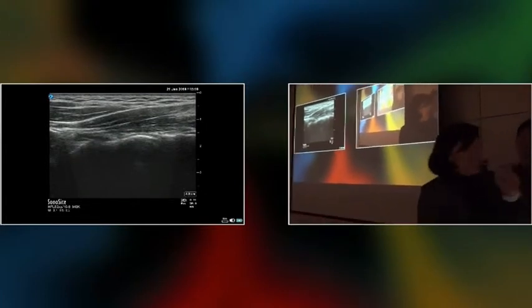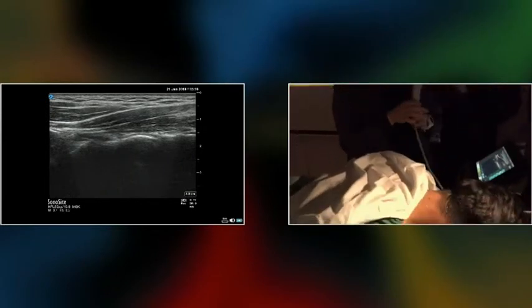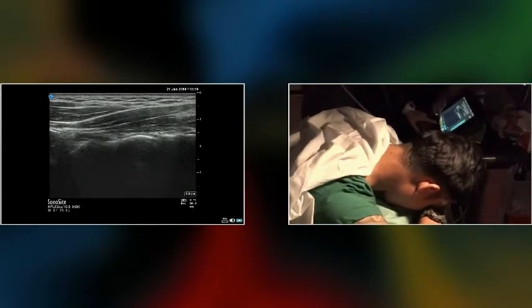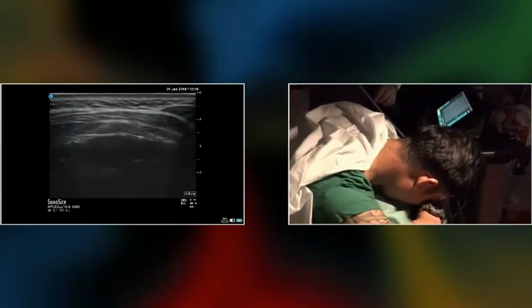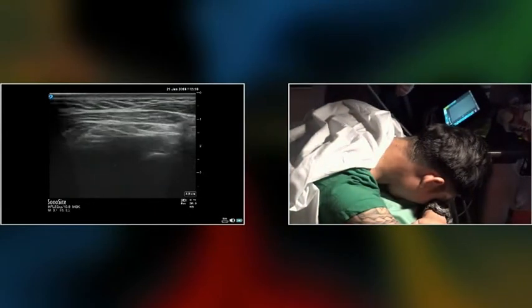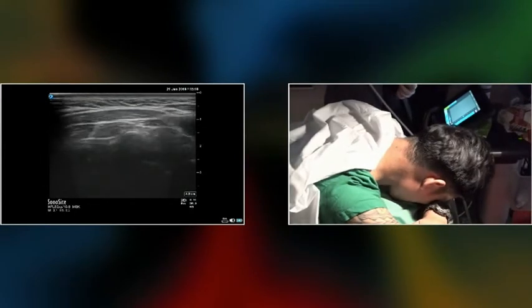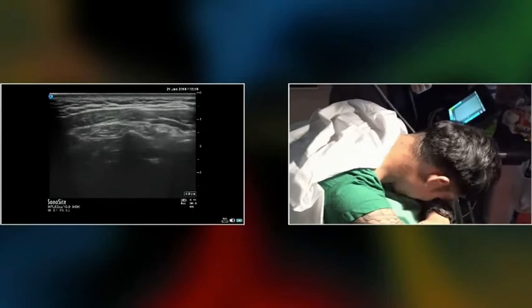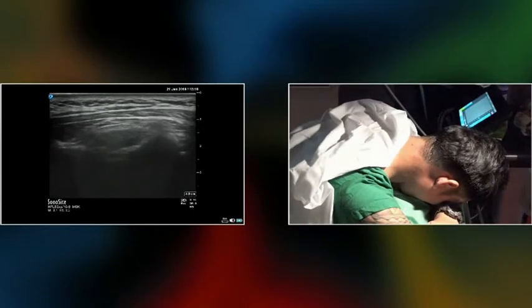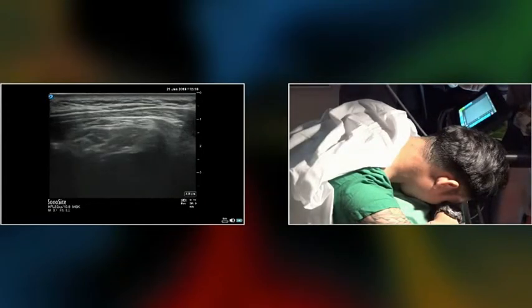I try to use this as a mic. So I want to show you on myself. Too many equipments, right? I think it would be a great idea if we teach, and then the ultrasound also can serve as a guide. So I just want to show you different anatomy, okay? Because I know that I have very tight fibrotic neck muscles, so that's just to let you know.